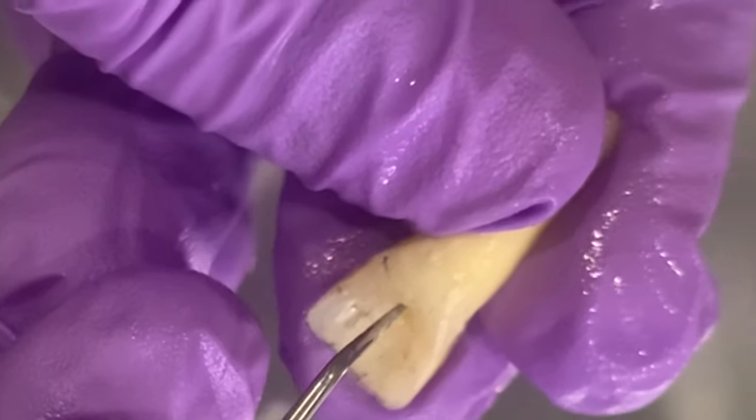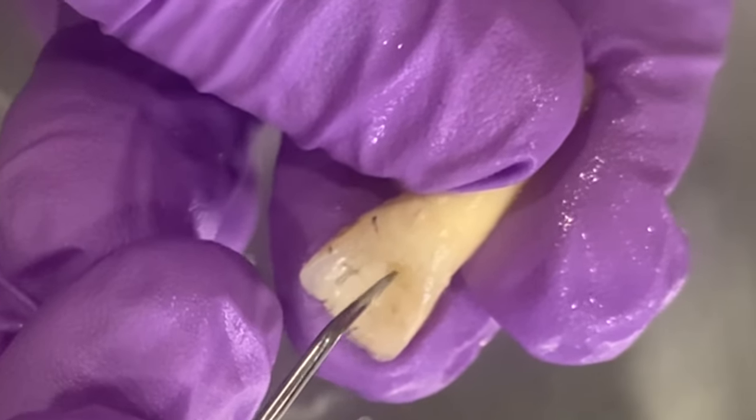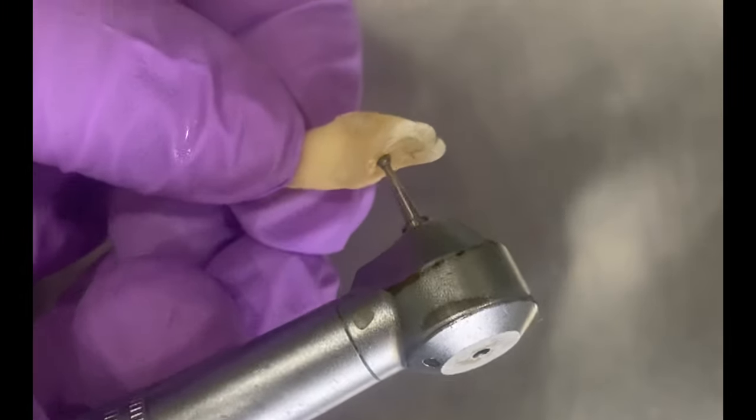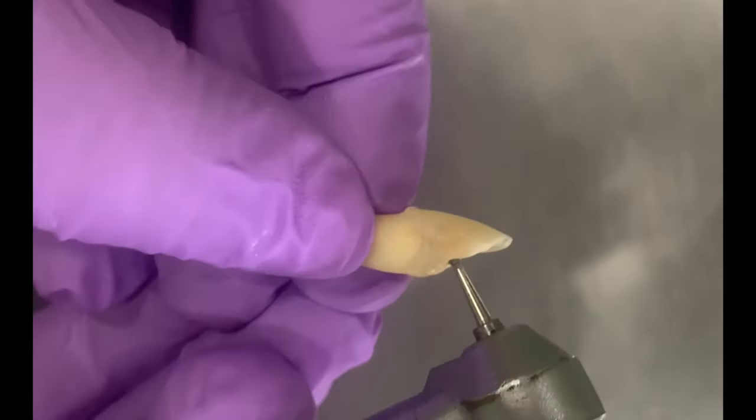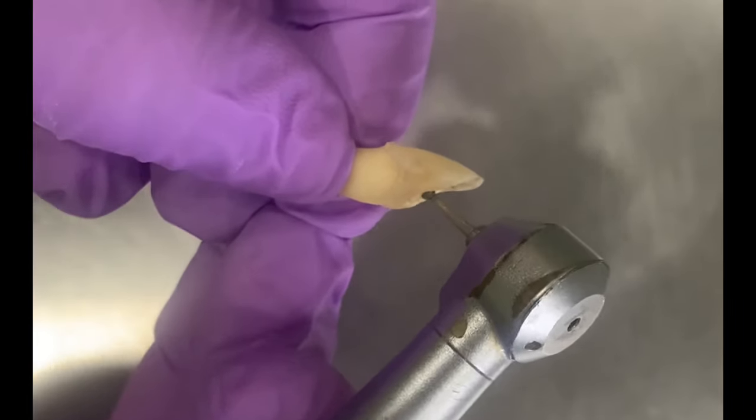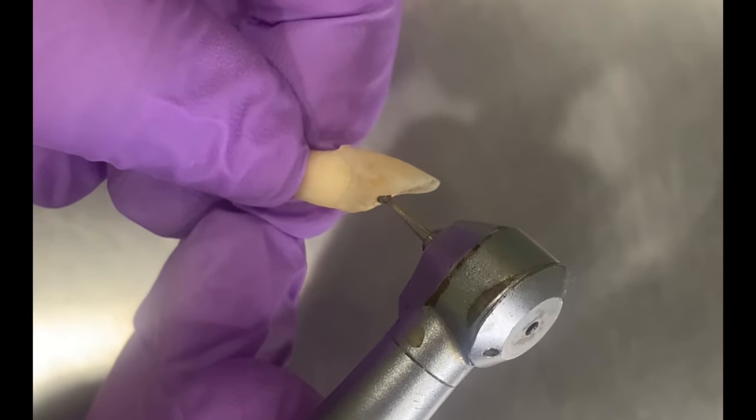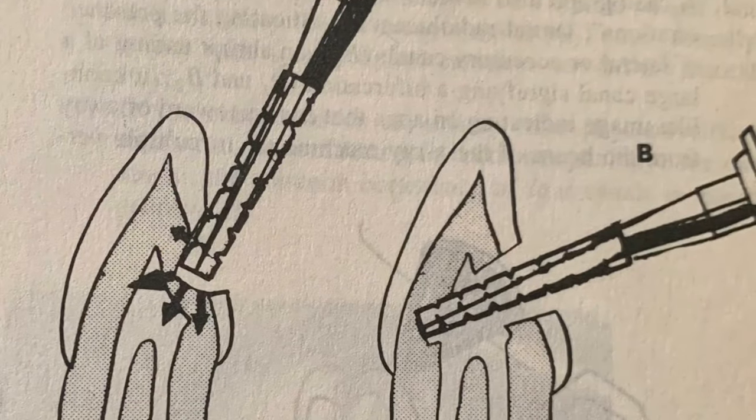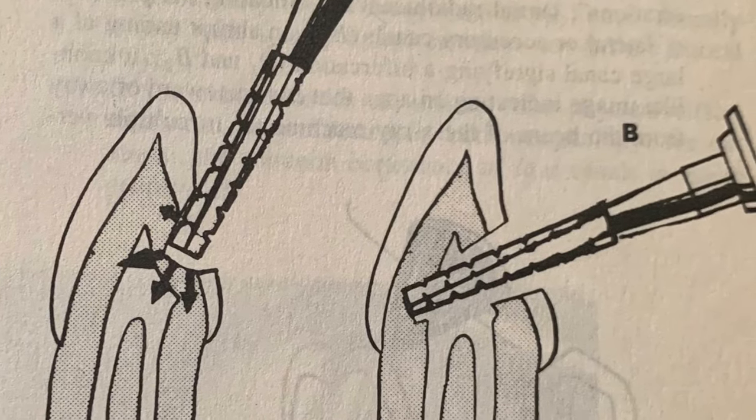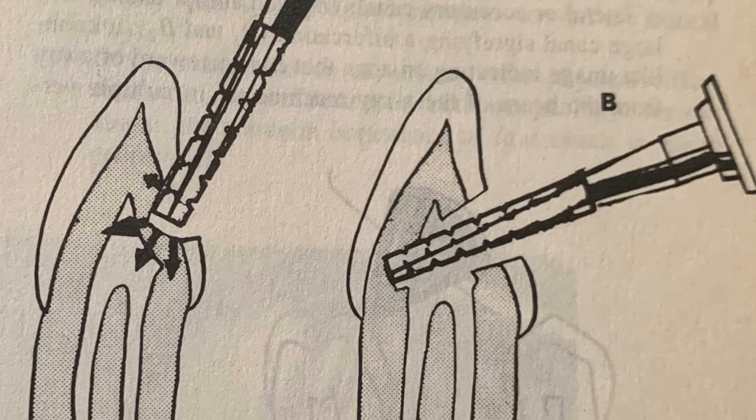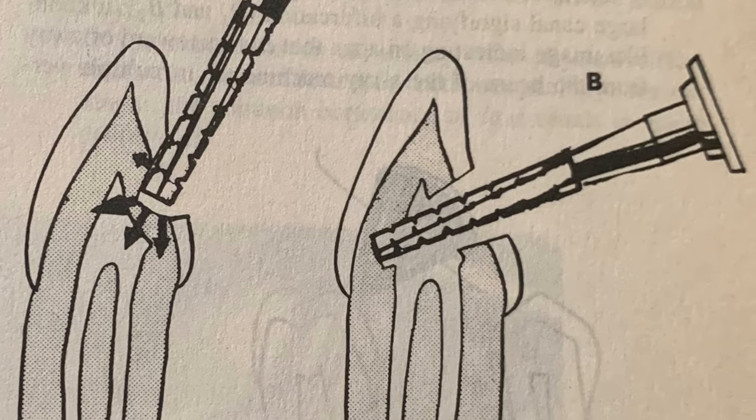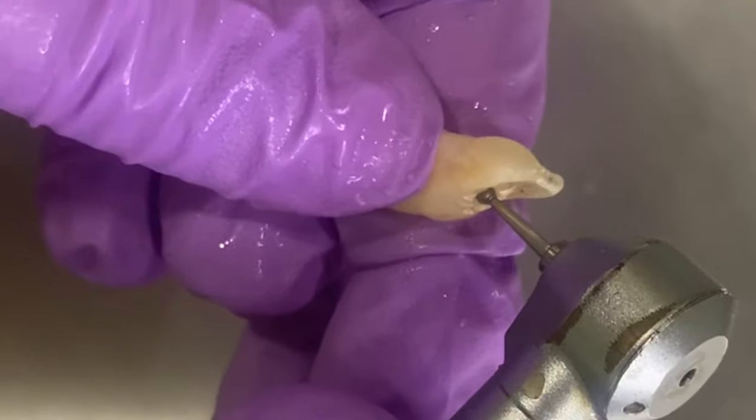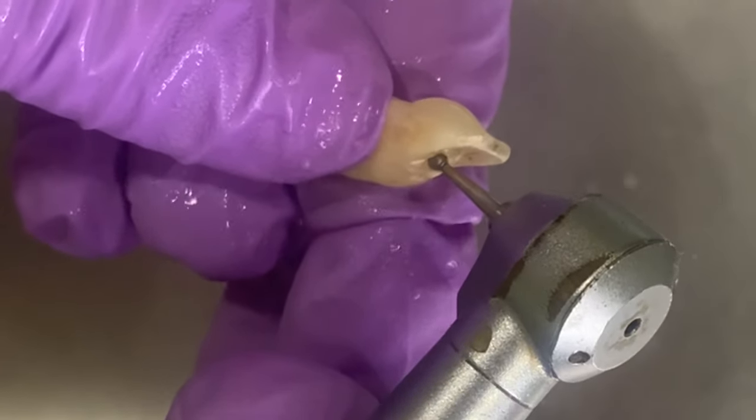Now we will change the position of the bur and we will hold it parallel to the long axis of the tooth in this way. We will enter straight into the pulp chamber and we will avoid any type of perforation. The bur is directed along the long axis of the tooth until the pulp chamber is reached.